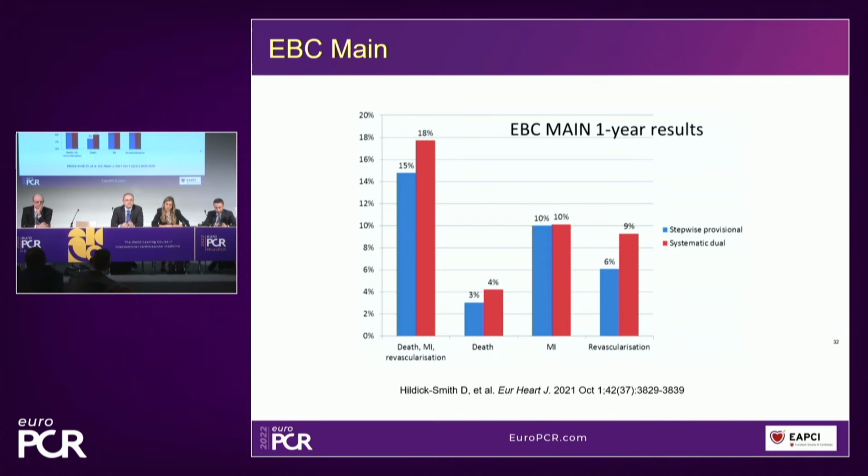The only time you would have a bailout stent strategy is if one of the following happened. One, an ostial stenosis greater than 90%. Two, less than TIMI 3 flow. Three, abrupt vessel closure. Or four, a fairly substantial dissection. Otherwise, you did not stent into the side branch. In the upfront 2-stent strategy, the stenting technique was left at the discretion of the operators. The 4 most commonly used were the DK crush, the culotte, TAP protrusion, and just the T.